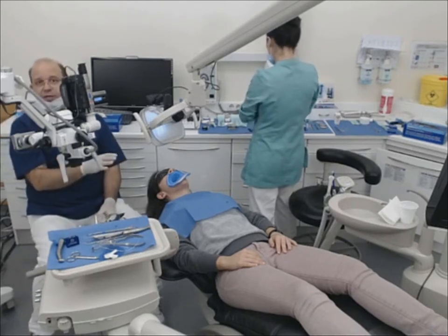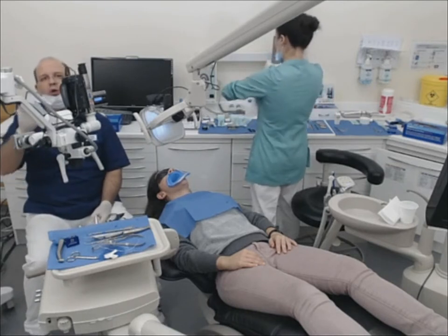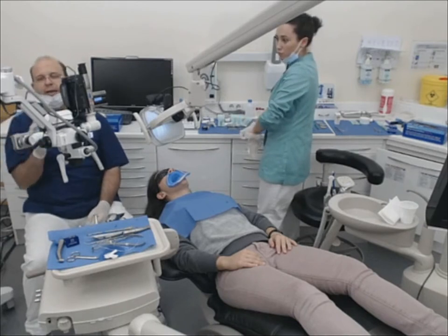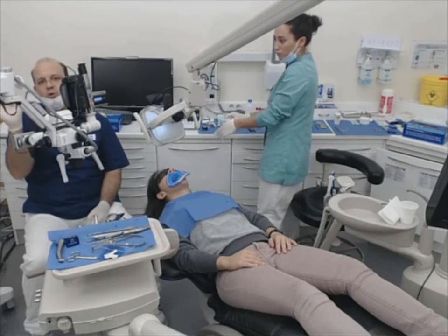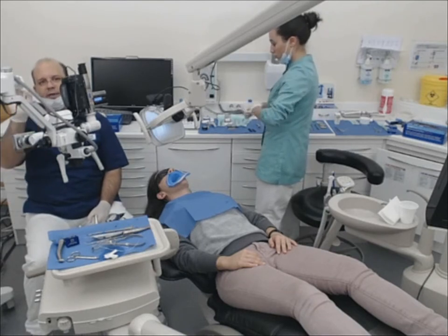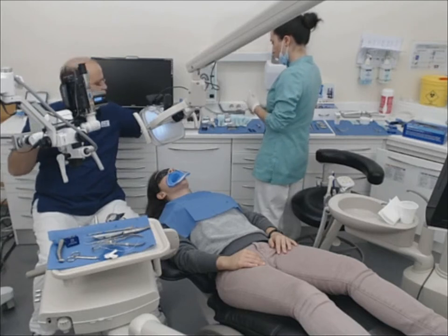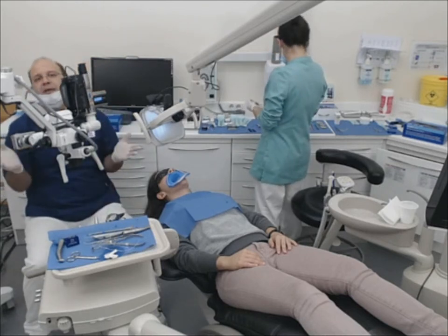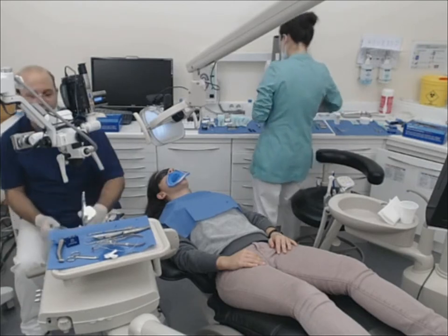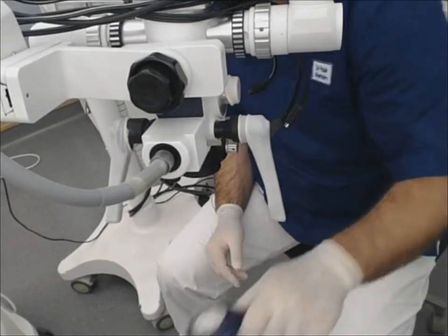For this patient, if you see, the other teeth don't have sulci with brown stains or white stains, so it's not needed. Okay, but I'm gonna show you how easy it is to do. Okay, just apply a very little bit of brown tint in the depth of the sulcus. But of course, it depends on the case. You don't need to do this. Okay, just to show all the possibilities you have when you work with this material.